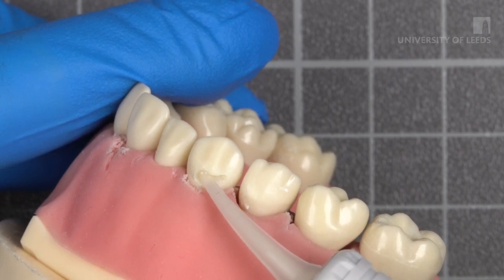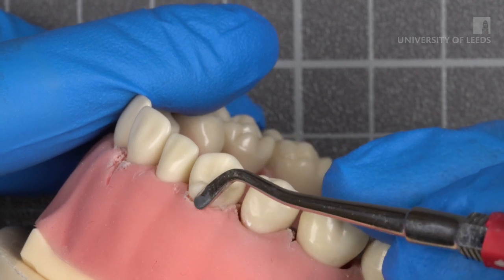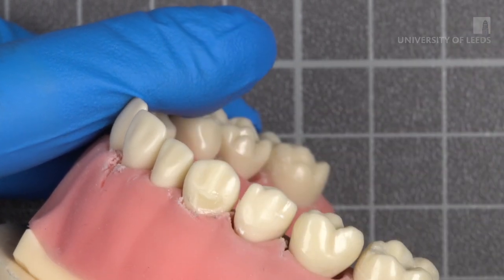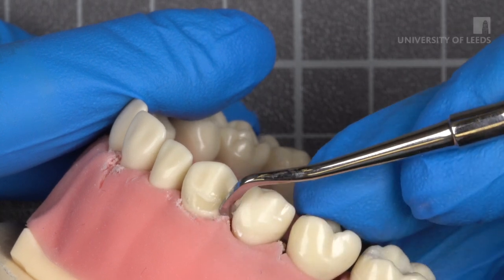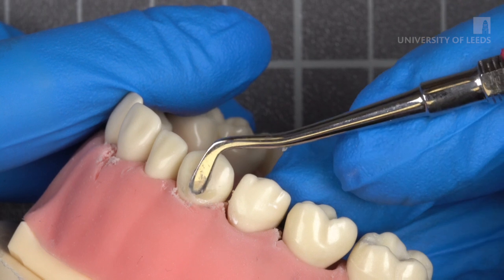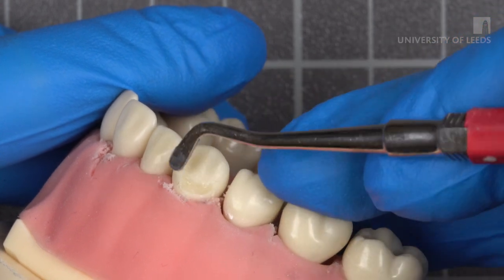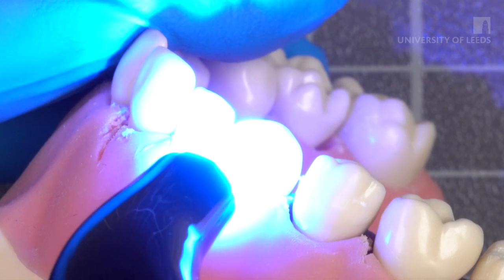Dispense RMGIC directly into the cavity. Compact it using a flat plastic while also beginning to shape it to match the convexity of the tooth, leaning part of the instrument on the GIC and part on the natural tooth structure. Add additional GIC as needed and continue to shape the material. The closer you can get during this stage, the less contouring you'll need to do later. Once you are happy with the contour, cure for 20 seconds.